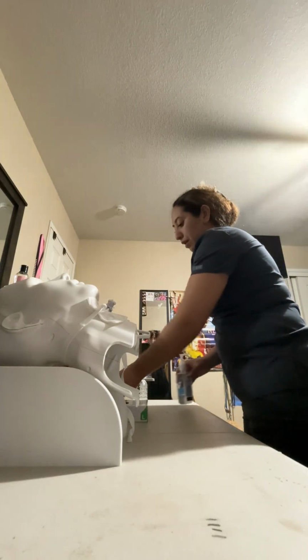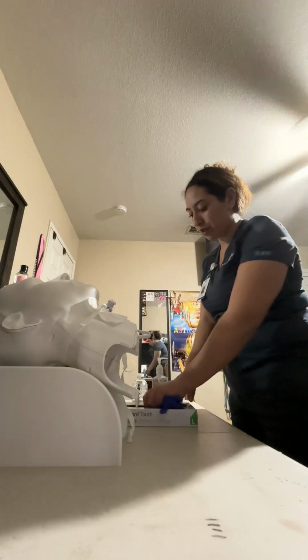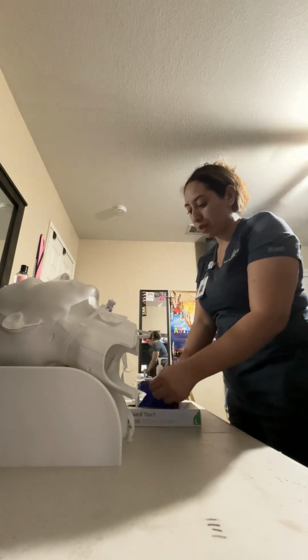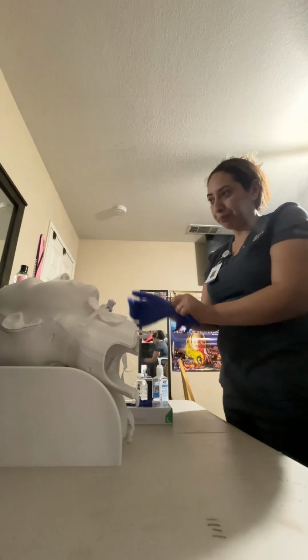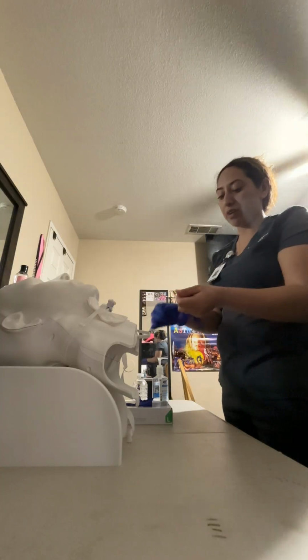I am going to put some gloves on and set up. So during this time, I will have already checked my patient's blood pressure, vital signs. I'm going to place a pulse oximeter on the patient's finger to monitor his saturation throughout the procedure. I'm going to go ahead and pre-oxygenate the patient for about 30 seconds to make sure that they have good oxygen airflow before we get started.